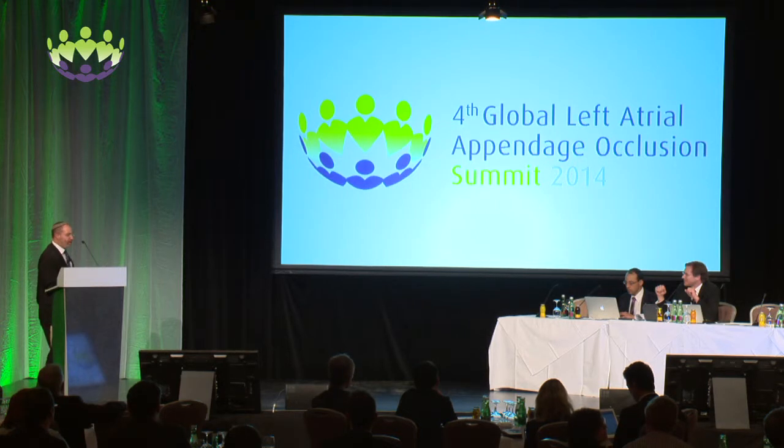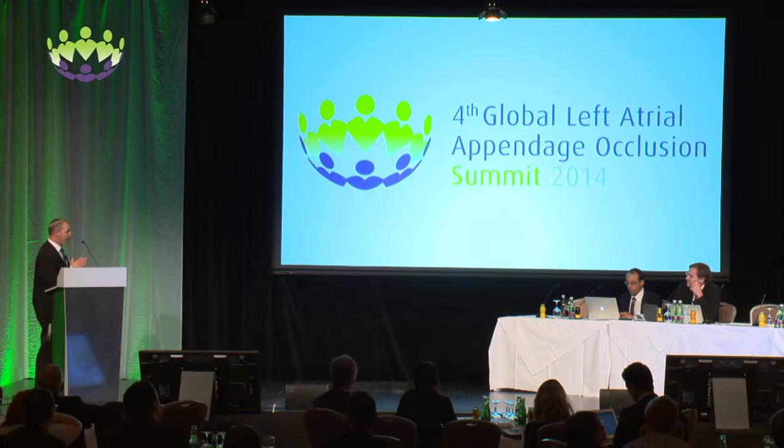Just your opinion, do you think in future you would benefit from, let's say, simulation, when you sit in front of a computer and you could implant on a 3D model? Do you think this makes sense for education, or do you think it's the situation in the patient with all the variables which make the difference? I think that, as an educational tool, simulations and 3D and holograms and 3D printing are all very exciting and have an enormous amount to contribute.